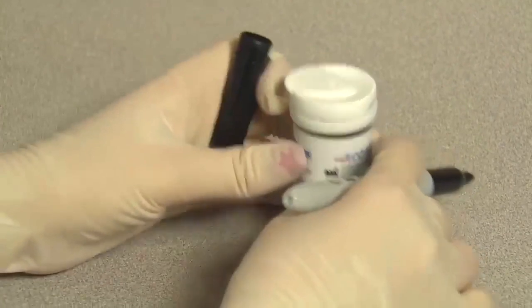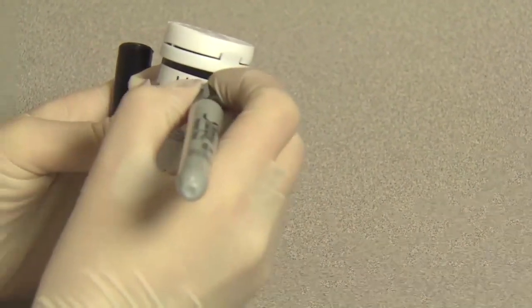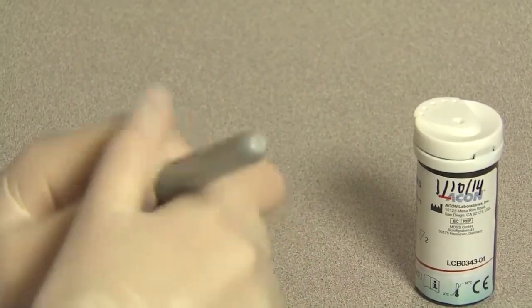Make sure to write down the date on the canister if opened for the first time. Discard after 1 year from the date the canister was opened. Unopened canisters have a 2-year shelf life. Discard after expiration date.